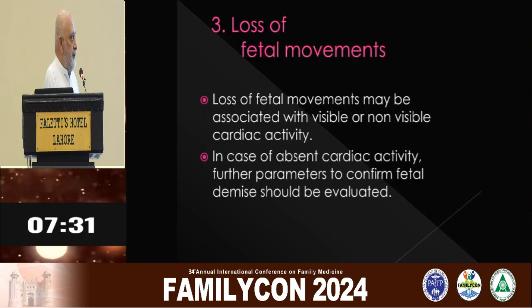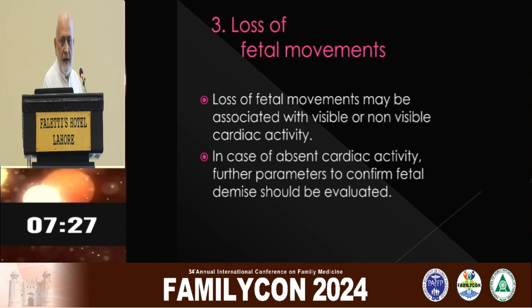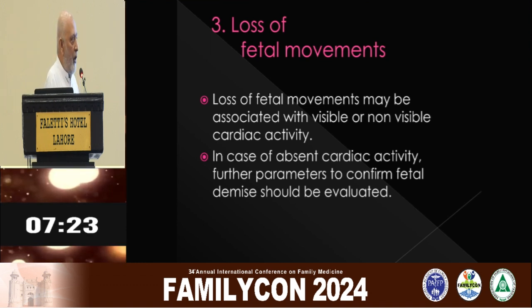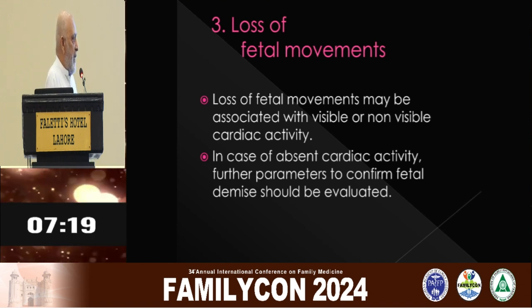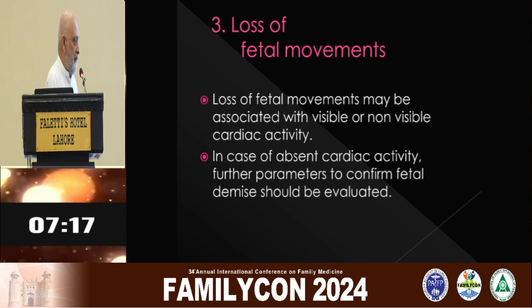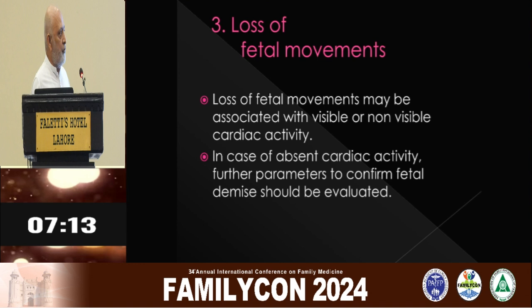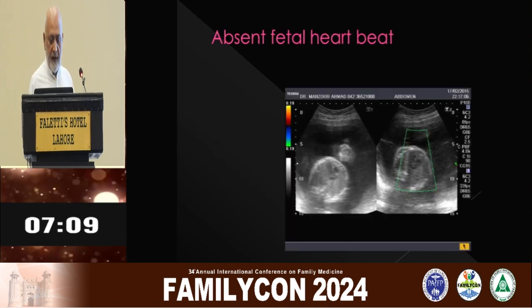The next presenting complaint is the loss of fetal movements that may be associated with visible or non-visible cardiac activity. Patients complain that the movements are sluggish or less, and we have to see whether the cardiac activity is there or not. If there is no cardiac activity, of course, it is a case of intrauterine fetal demise.